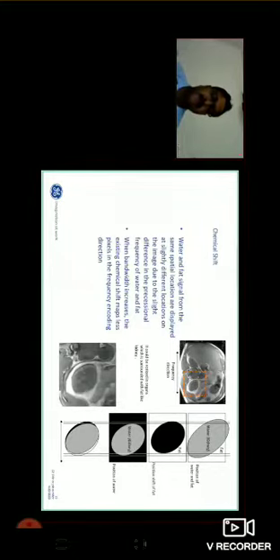So increase your receiver bandwidth or use fat sat techniques. And you can do one more thing: you can shift the artifact location. You can change where you want to see the artifacts, whether you shift from right to left or from superior to inferior. That you can change during protocol optimization.